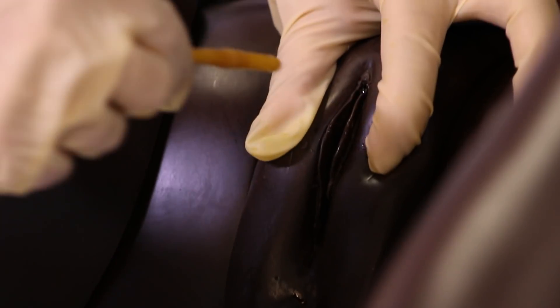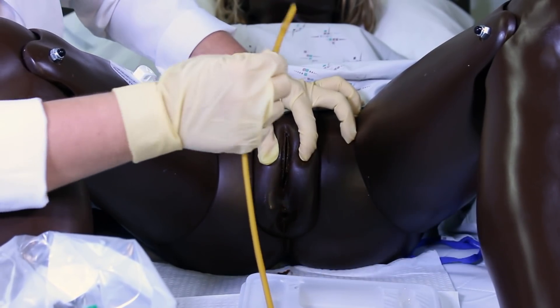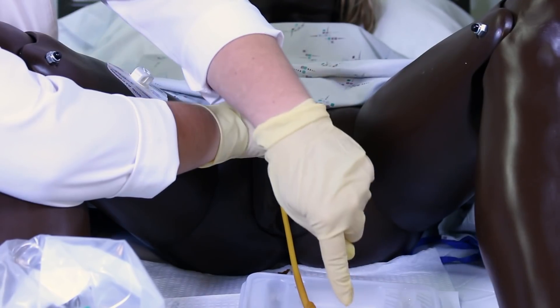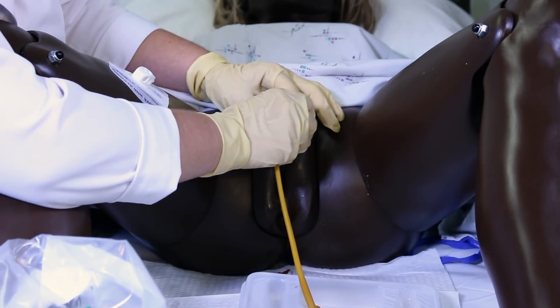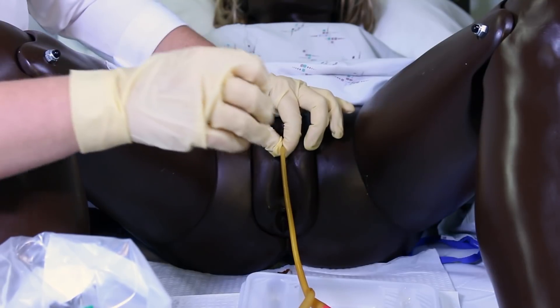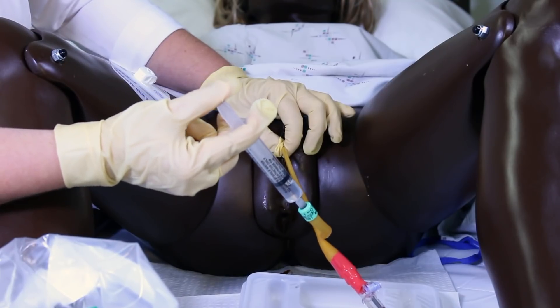Take the catheter, holding it about three inches from the tip, and insert it into the urinary meatus. Soon I should see urine flow coming back into the catheter tube, and at that point once I see the urine flow I insert it another two inches — but check your facility policy on that. Then I brace it with my non-dominant clean hand and inflate the balloon of the catheter with the full 10 cc's of water.